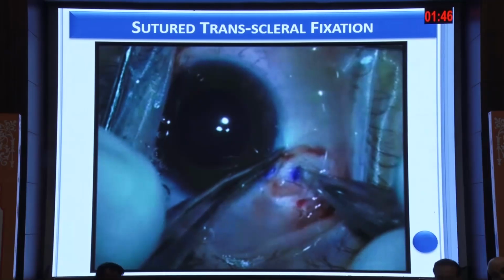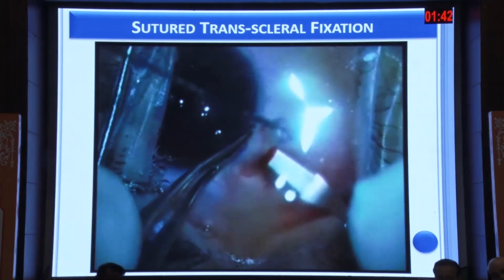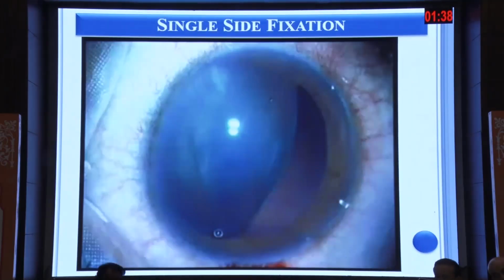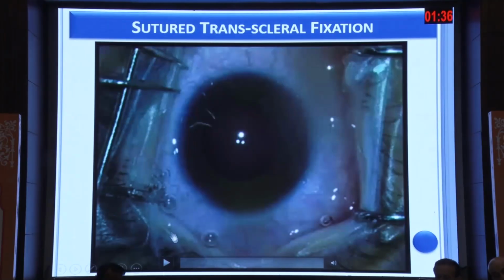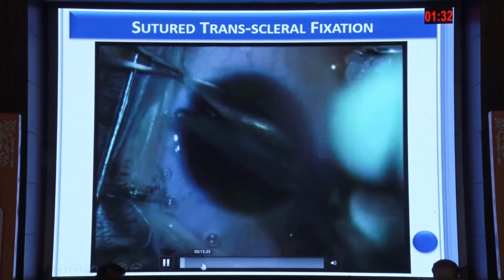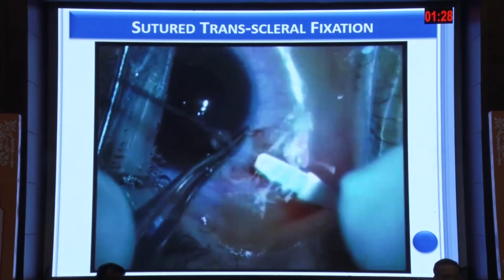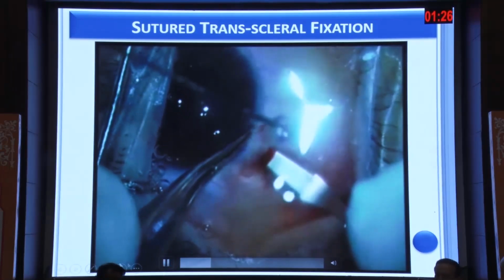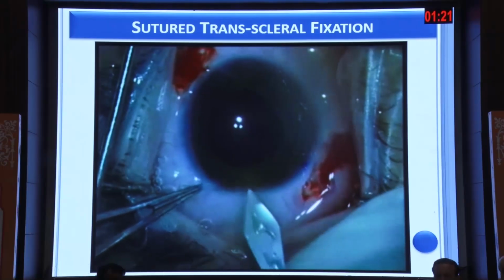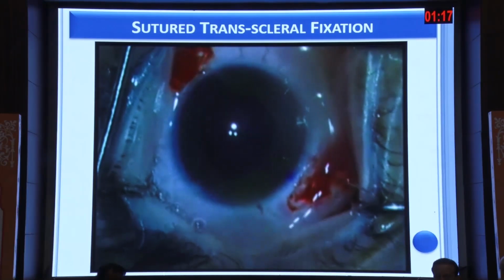The groove has been made. I am just fast forwarding because it was already shown. The main port has been made.